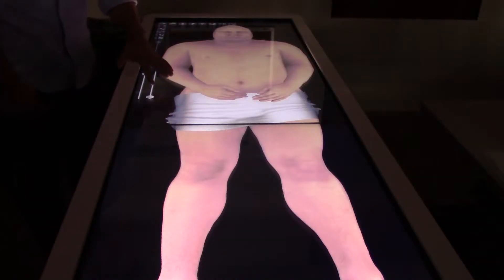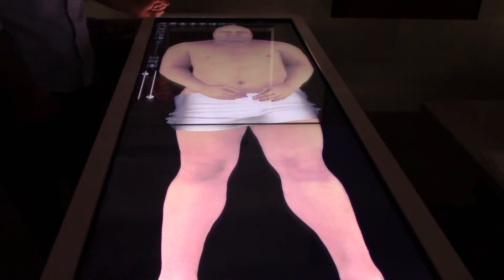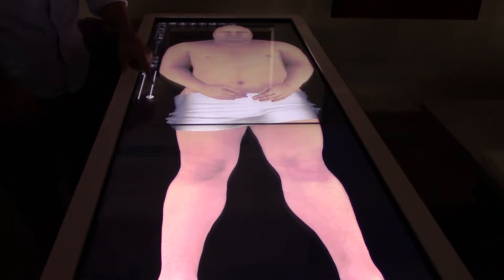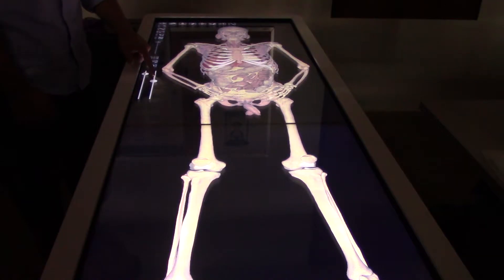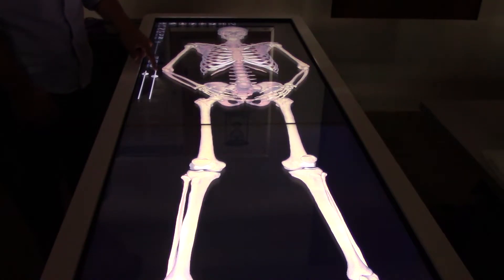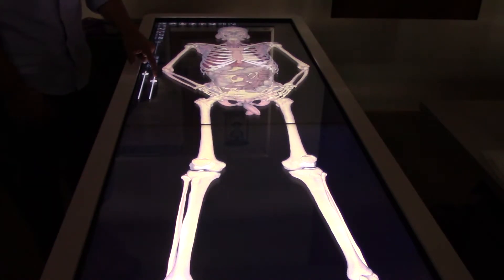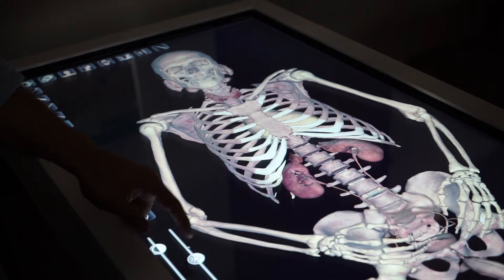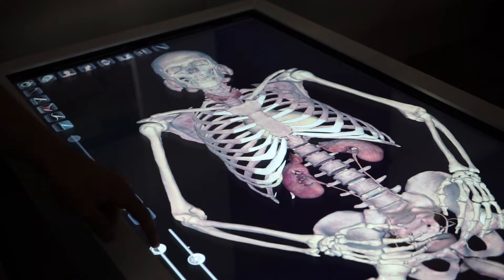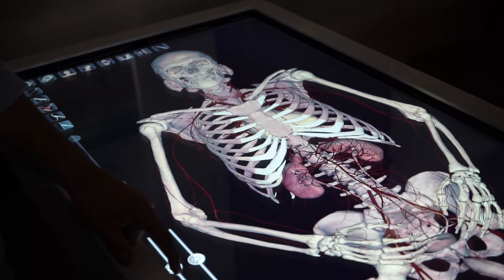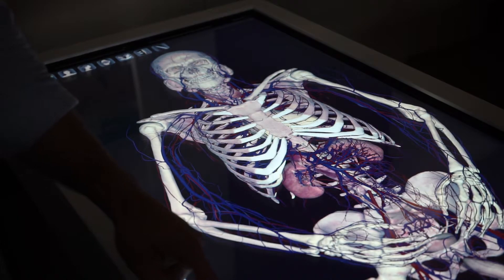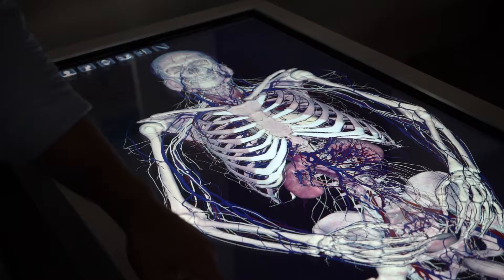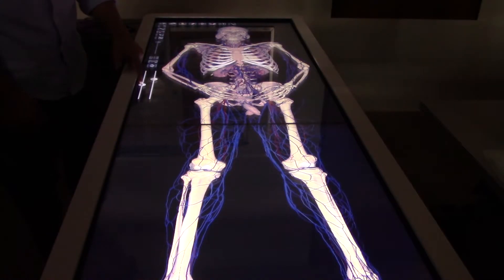There are two sliders here on the bottom. One is brightness and one is contrast. We'll start with the brightness — as I move it to the left it slowly removes layers, starting with the skin, and eventually going to the skeletal system. The bottom slider is the contrast slider, which displays more detail including the veins, arteries, and nerves.